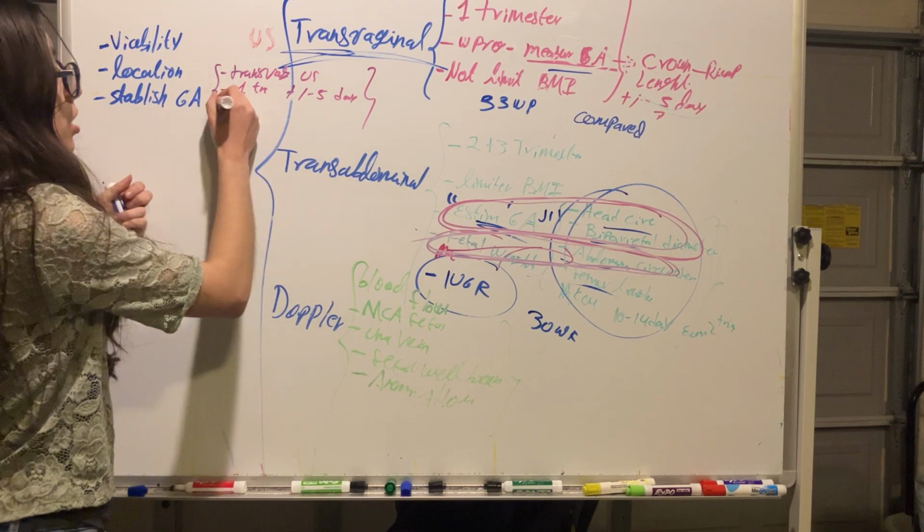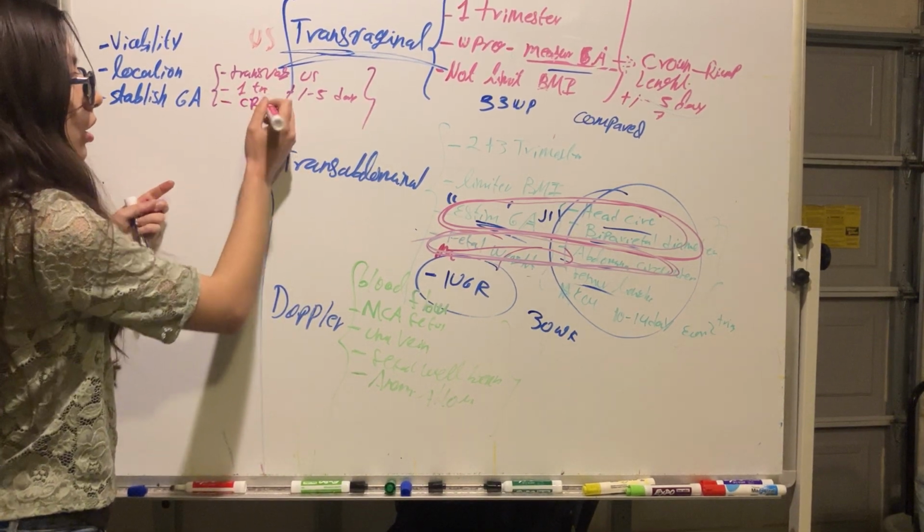And this measure is done with the crown rump length.